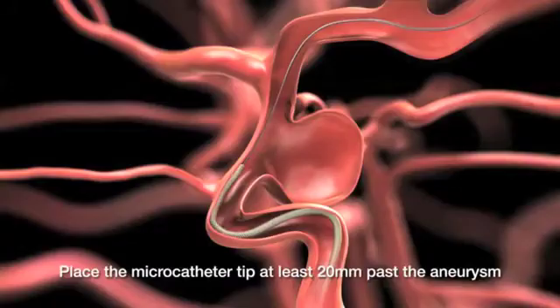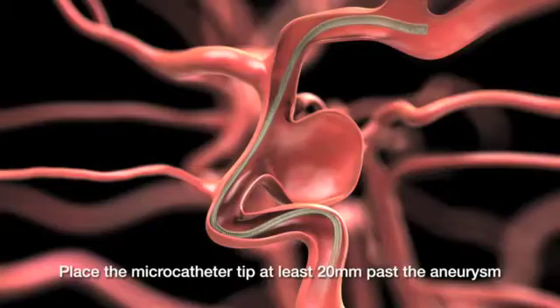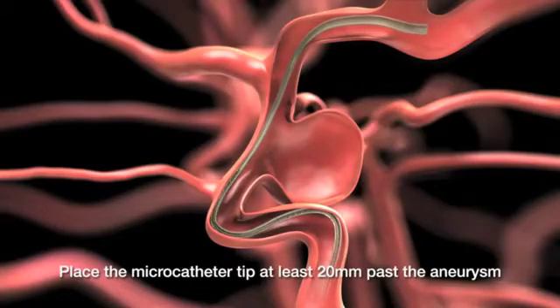We get past the aneurysm through the carotid artery with a microcatheter. Through the microcatheter, we deliver this pipeline embolization device, which is a flow-diverting stent.